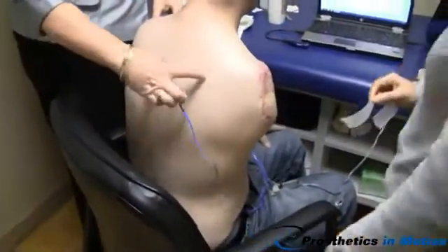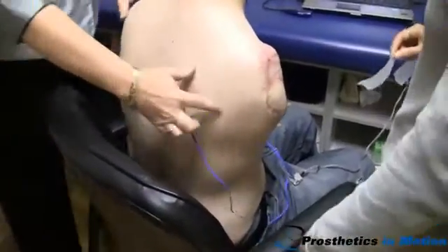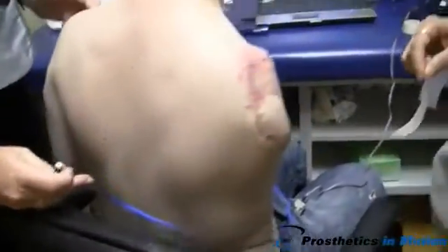So let's start first in the back, because we know it's pretty strong. Let's have you bring the muscles together in the back again for us, coming straight back, straight back again.